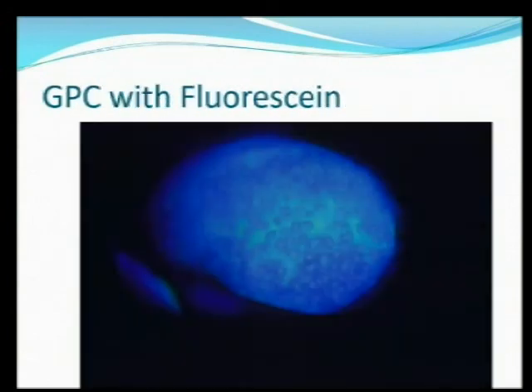If you want to get a little better look at the bumps, if you put in fluorescein, that vegetable dye that we talked about for tear breakup times, that will highlight the papillae. And in advanced stages, we'll even show staining at the apex of the papillae.